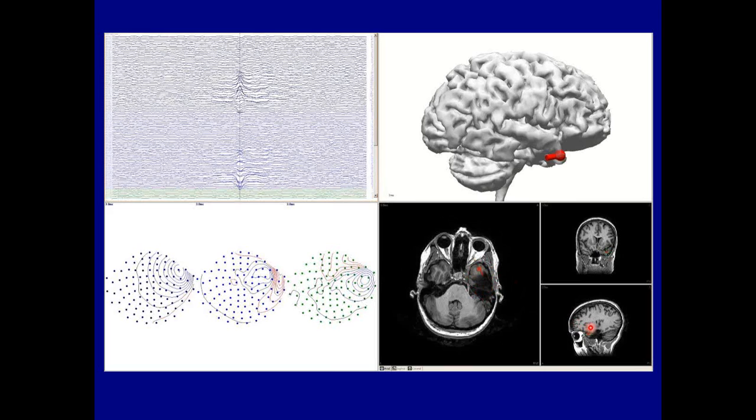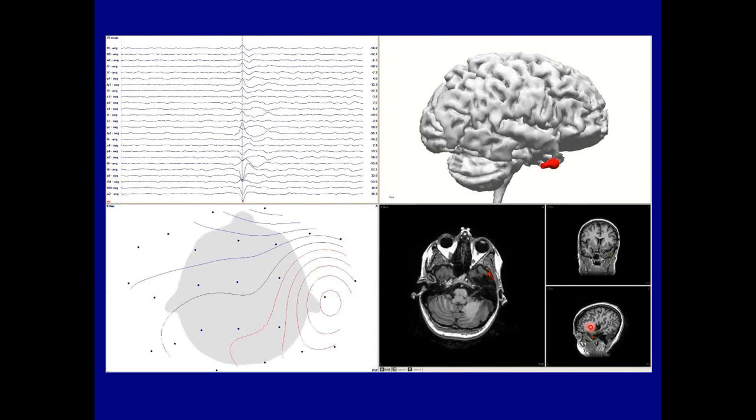Very nice localization. It doesn't care. Whereas the EEG, we have this tangential field. EEG is not as accurate, again, rather superficial because of the breach. But with fields, particularly tangential fields like this, the source is not up here under the negative maxima or back here under the positive, but it is between the two.